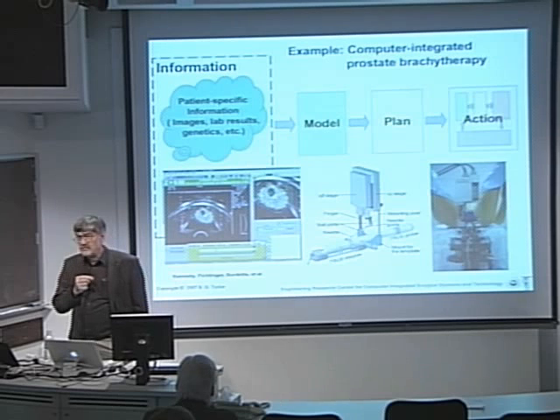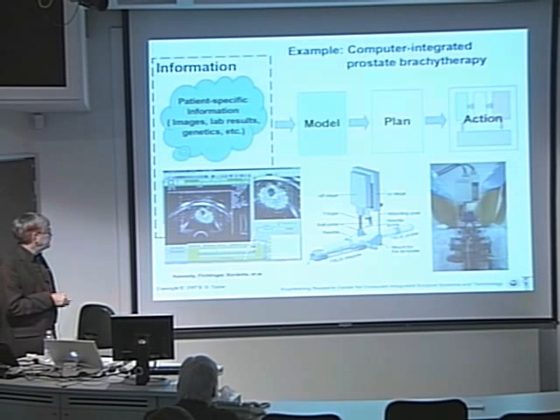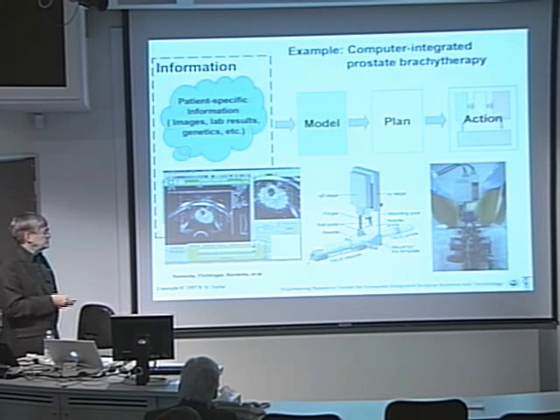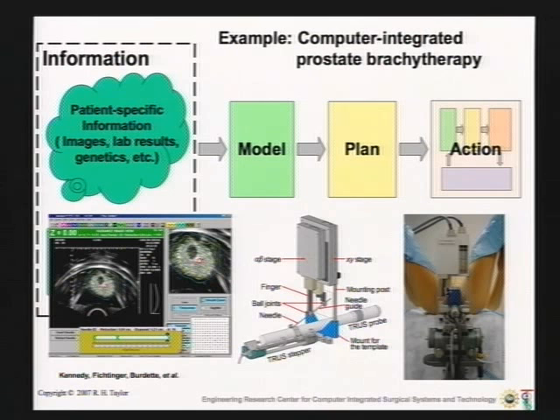Here's an example. This is a system that we developed with an industrial partner, Cliff Burdett, combining a commercial prostate brachytherapy planning and guidance system, which is based on intraoperative transrectal ultrasound, and replacing the little grid that they normally use for telling you where the needles should go with a very, very simple robot. The advantage of this, aside from being faster and less error prone, is you can actually control the angle of the needle. And that can often be important. For instance, the pubic bone can be in the way, and with the conventional method, you can't get a needle to the target. So again, this is an extremely simple robot, but the important thing is you've integrated it back with a planning system, sort of one-stop shopping.